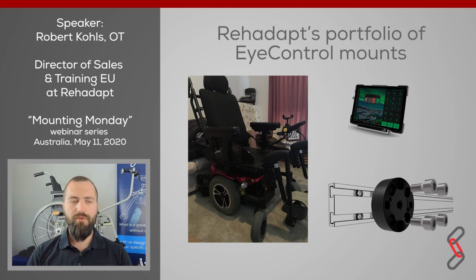So a question for you, write it into the chat. What do you think? What could be a solution? What could be the mounting apparatus that we would use for that kind of wheelchair? It is a very active chair. The seating plate is getting tilted, the backrest could be tilted. So what kind of mounting solution would you use for that kind of customer? Write it into the chat. I would be interested to know your first thoughts when you would choose a mounting solution for that kind of chair.